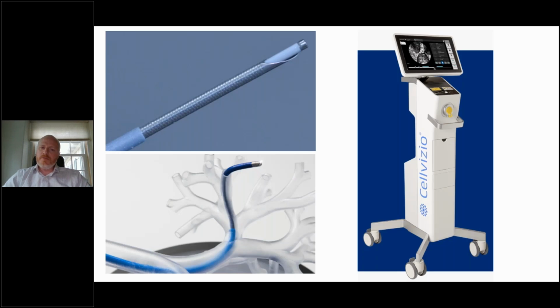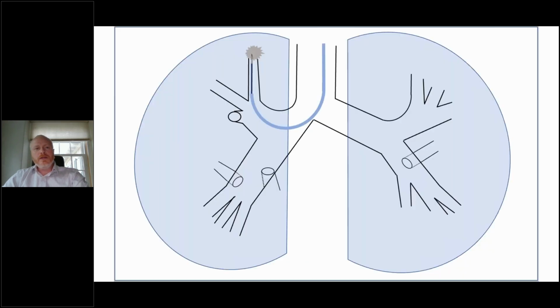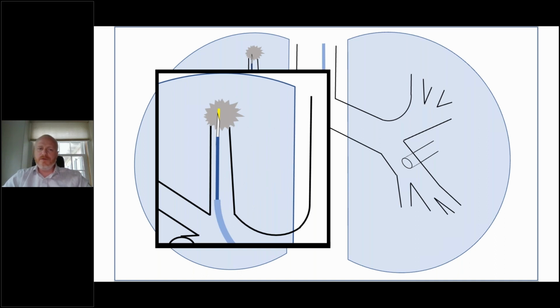So we've done some early work combining robotic bronchoscopy with confocal laser endomicroscopy. This is a needle-based probe. You can see in the top of the screen there, the probe is housed within a 19 gauge needle, and the probe acts like the stylet. When you drive out to the lesion, you can introduce your needle, and that needle houses the confocal microscopes. You can image with a depth of about 150 microns and see what the needle sees, see what's coming in front of you. If you don't see lesional tissue, you can make small adjustments and re-image.